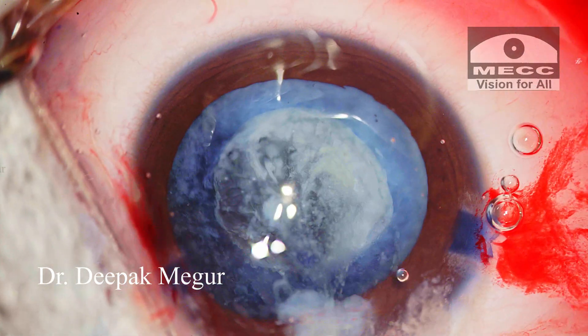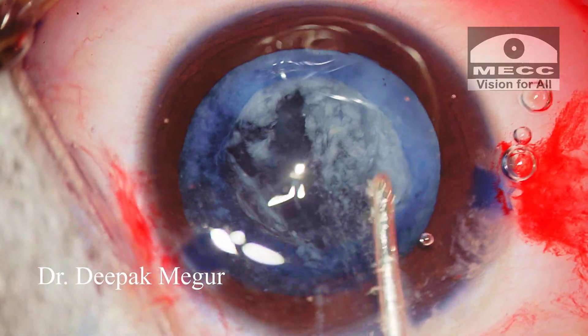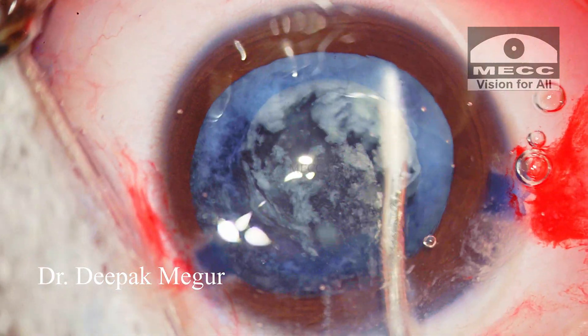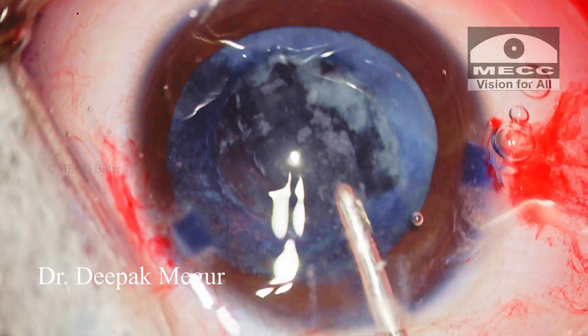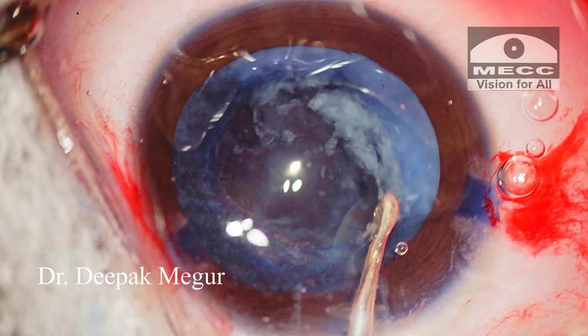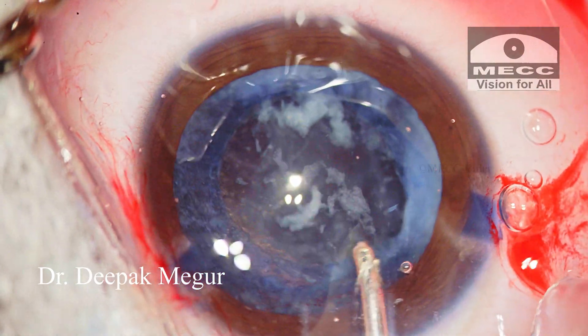As is evident, there is no nucleus here. The entire lens matter itself is liquefied and in fact partially absorbed. A little bit of irrigation expresses all the loose lens material. The remaining cortex which is sticking onto the posterior capsule is aspirated.